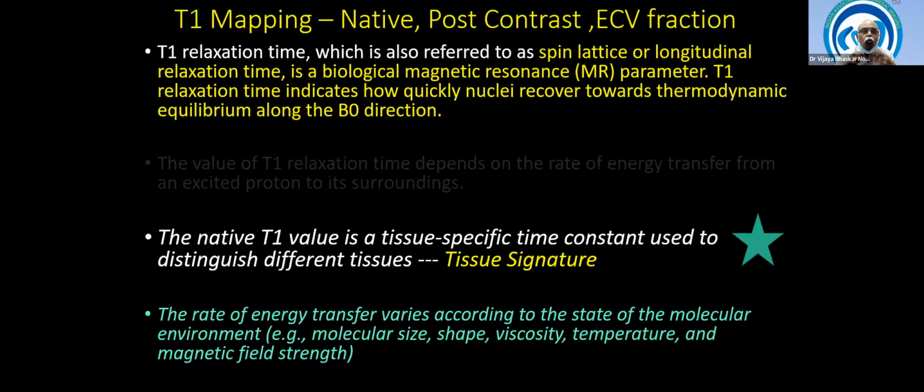Coming back to what is meant by parametric mapping. What is parametric? What is metric? Metric is measurement, any form of measurement. So parametric mapping: what you are doing is measuring T1 map values or T2 map values and comparing them with already measured, established normal ranges available.